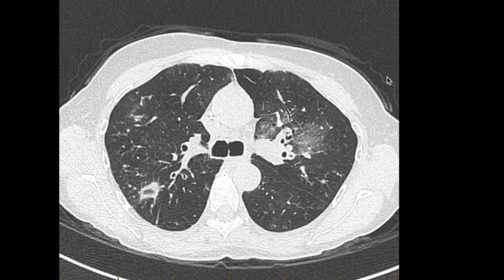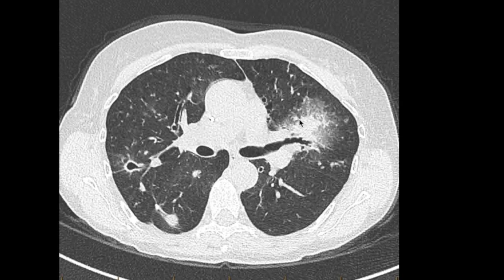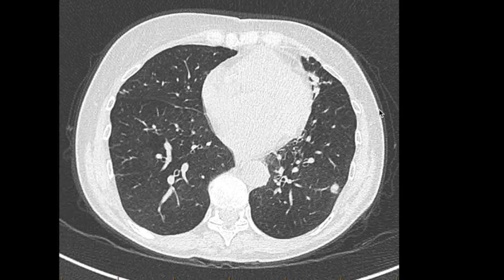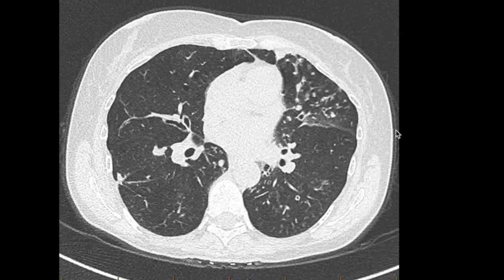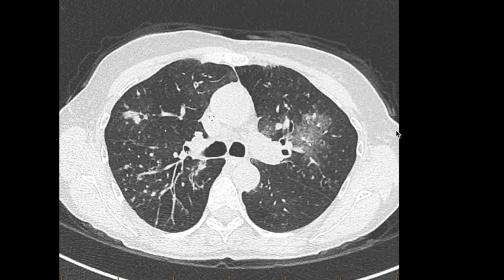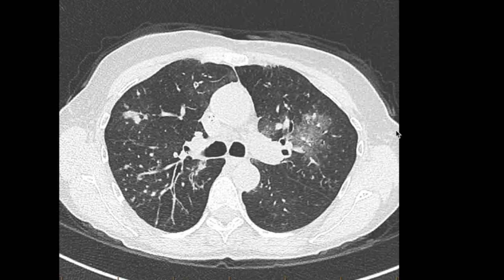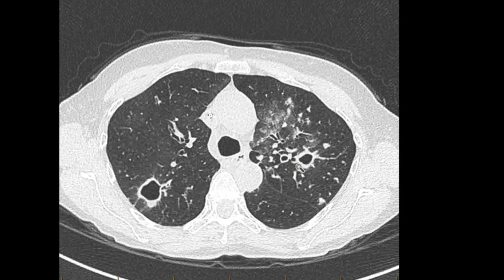As we come down we can see these airways are quite thickened and dilated. In the lingula there's a mass-like lesion with some surrounding ground glass. Further nodular areas with possible cavitation, and down into the lower lobes you can see further nodules, cavities, and thickened dilated airways. Let's have a closer look at this cavity in the left upper lobe — the apico-posterior segment — and follow this segment out to that cavity. You can actually see that airway goes straight into that cavity.